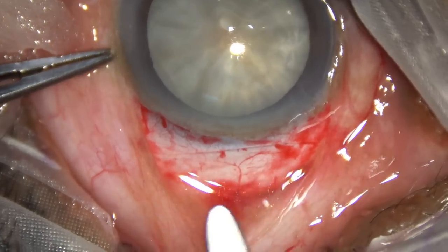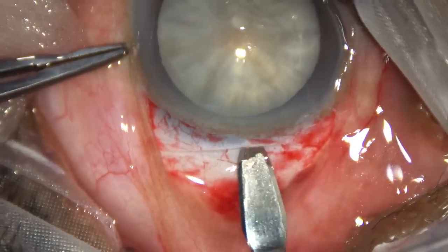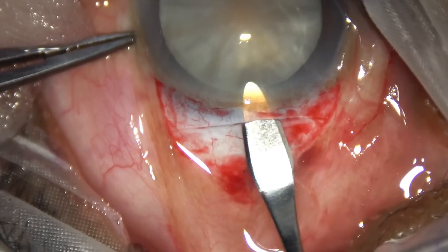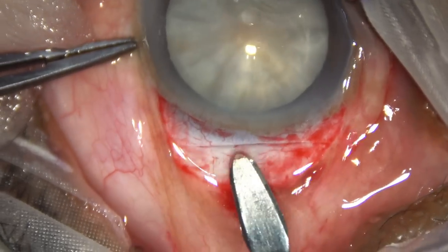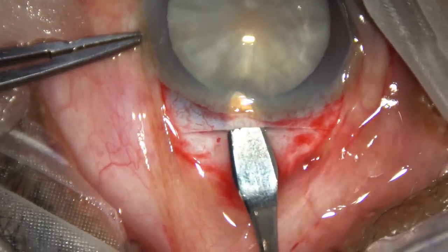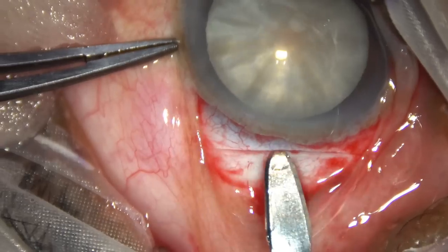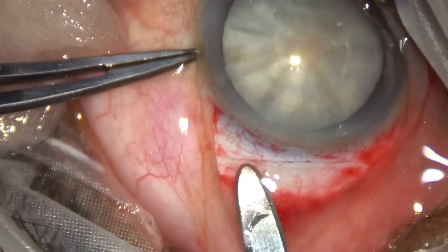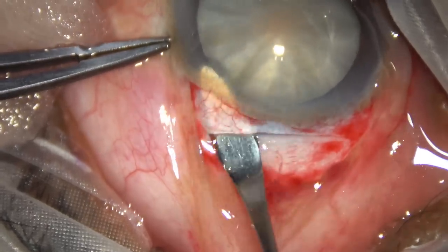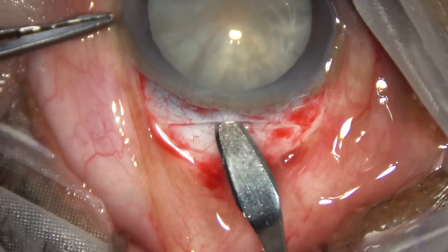And now we have to start making the tunnel. I start at the middle, with this sweeping motion, go into clear cornea, and then come back. This kind of motion. Go forward and come back to the left side. And now from here to the right side, it will turn like this.